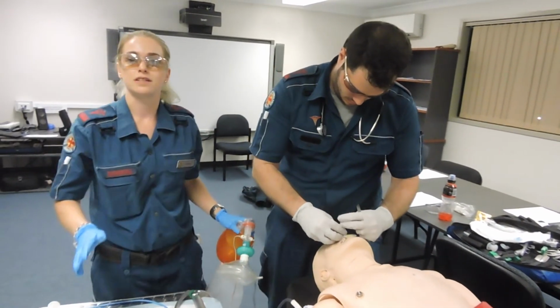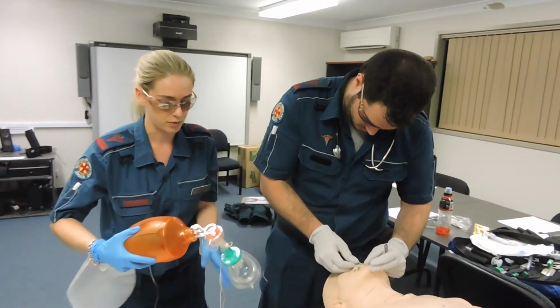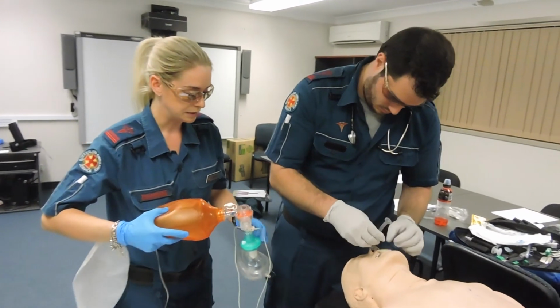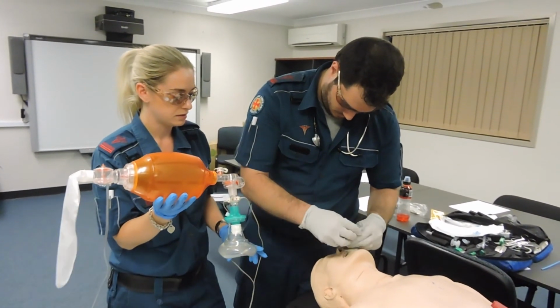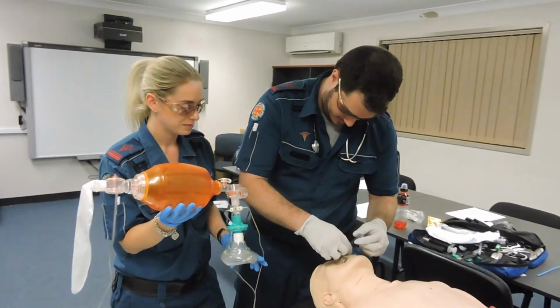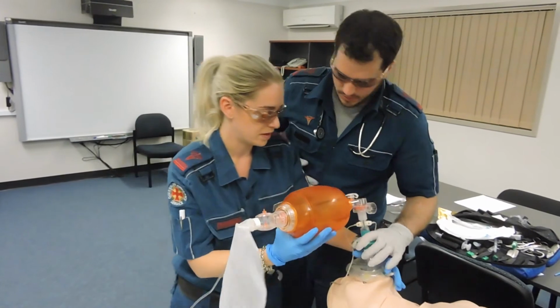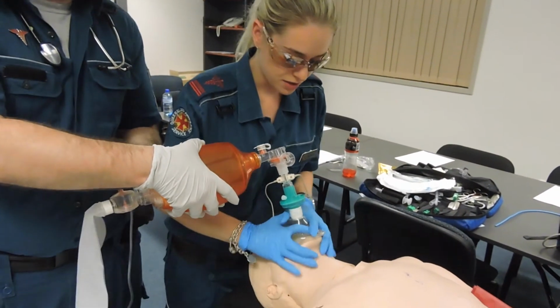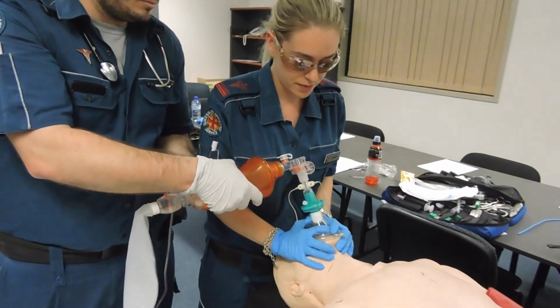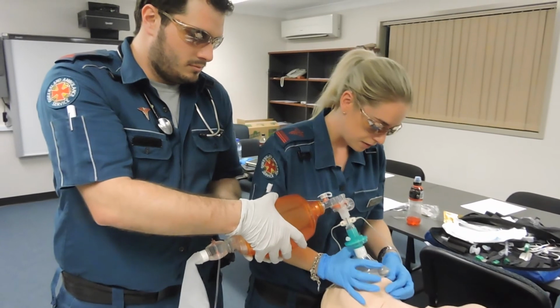Now, in this situation, it's important to have the most senior clinical person with the most experience with airways jump in, because we have one more attempt at intubation. Alright, I'm going to take over, Ben, if that's alright. Now, I'm going to do 2-handed technique. Can you take hold of the BVM for me? So, just going to ventilate at a normal rate for me.